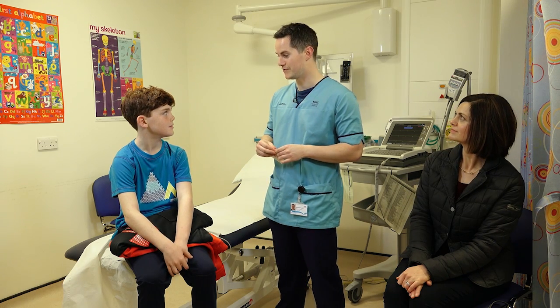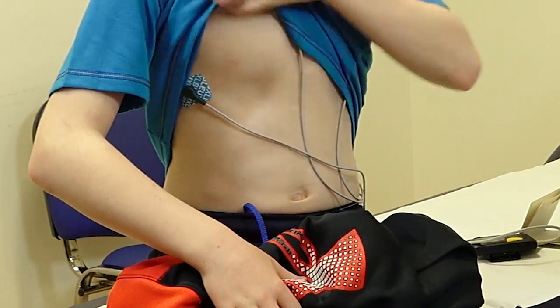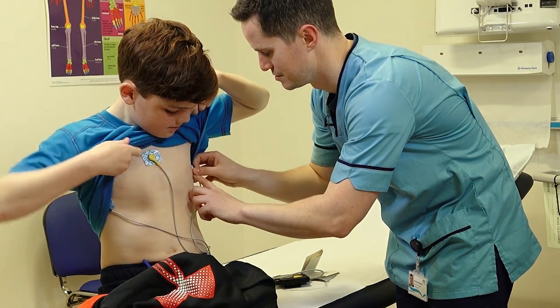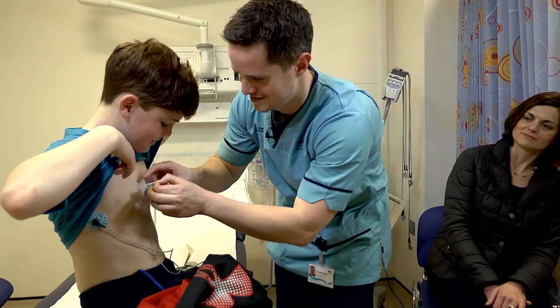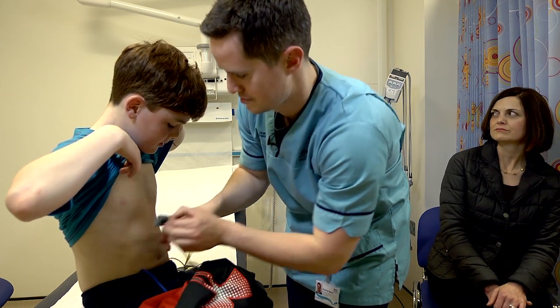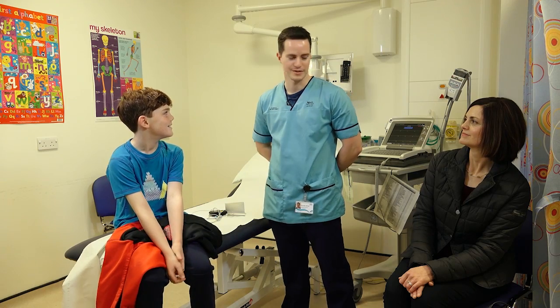So what we will do now is relieve you of the monitor. These can be a little bit sticky coming off. A bit sticky. Yeah. Thank you for showing me how this works. No problem Sam. Enjoy the rest of your day guys.